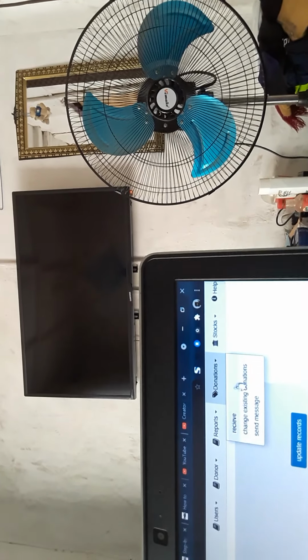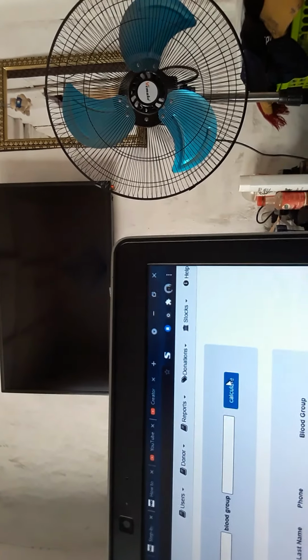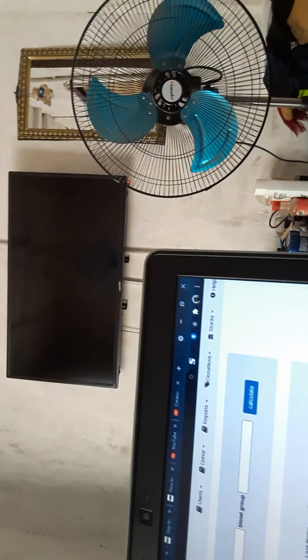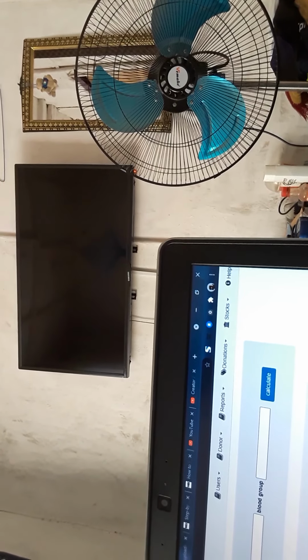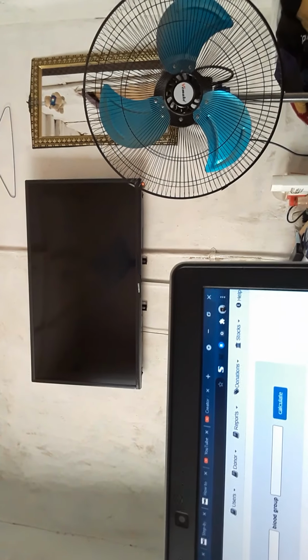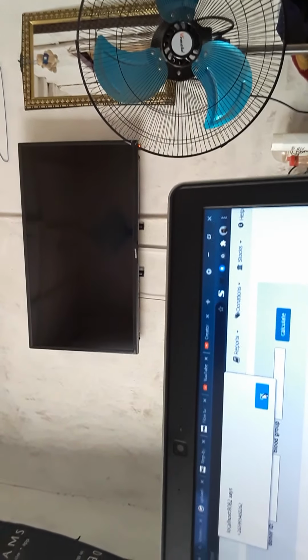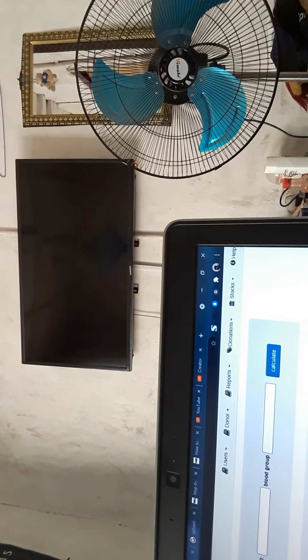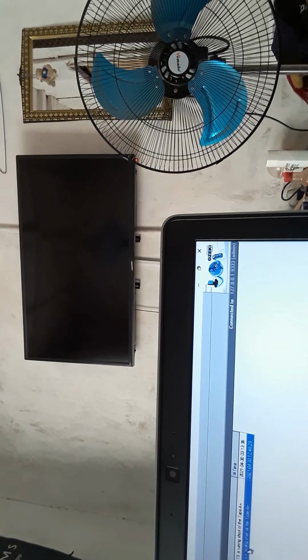The other crucial part is the sending message part. If you feel there is a need to send a message to a donor, you click on the donor, then send message to donor. It will show you that it's sending a message to that number. After you press OK, the message goes into a message queue. At the moment, this is the message queue that we have.